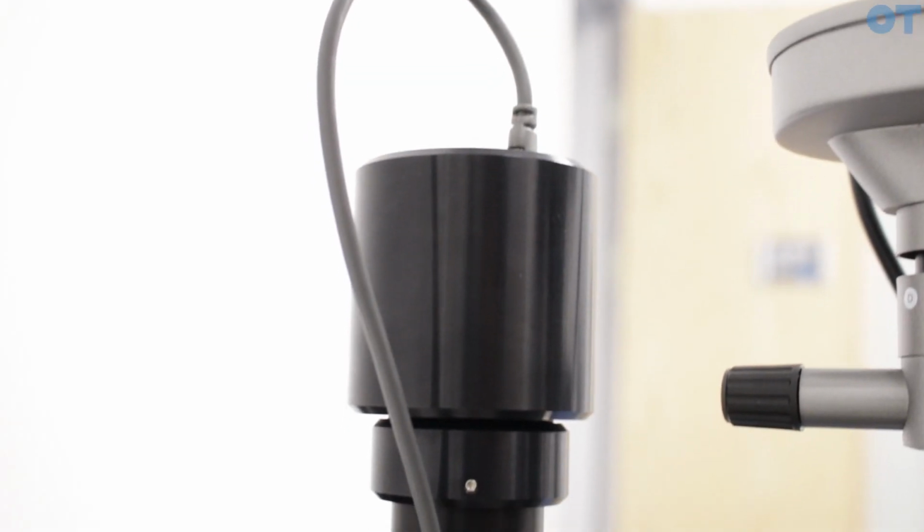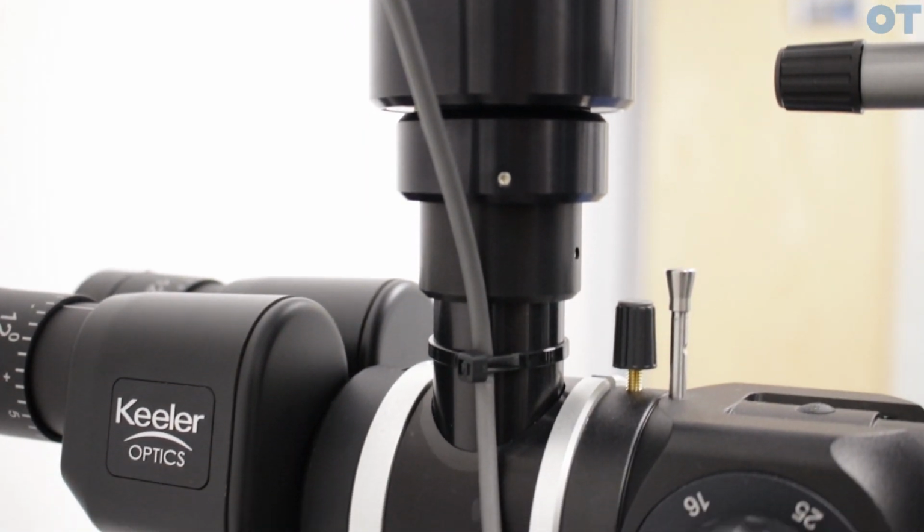Each examination room is set up with a digital slit lamp system, so we are able to image through the slit lamp itself. And the way that we use this system is twofold within this facility. We use the system as a recording tool. What it is also useful for is a training mechanism. We can use the camera as a closed circuit system, which enables us as supervisors to sit back and look at the screen sat above the student's head, and so we can observe what the student sees through the eyepieces as they're undertaking an examination.